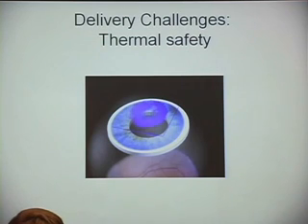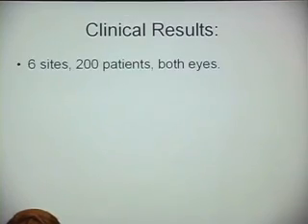So every treatment we go through, we analyze it from a thermal point of view and say, okay, what's the temperature? Then we rearrange the pulses and change the timing in such a way that we'll stay at a safe treatment temperature, but get it done as quickly as possible. So we put it out there, and in fact, it works pretty well.